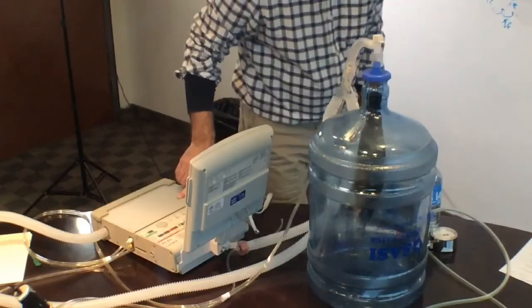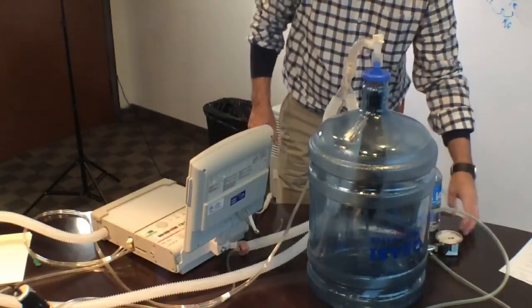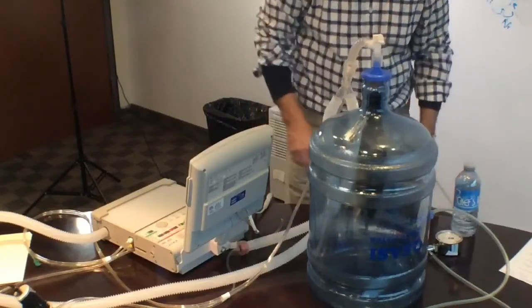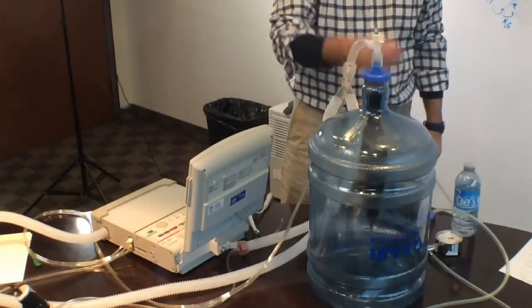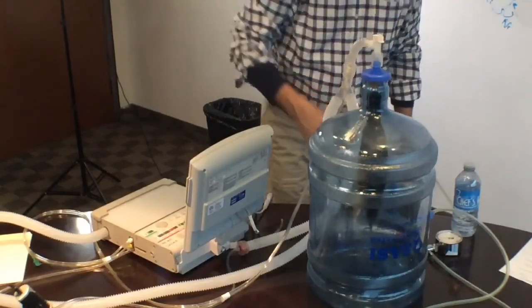Okay, so the honking sound that you hear, those of you from the CV4 days, sounds like the CV4, and it's exactly the same kind of principle. It's that gas that's trying to escape through a positive bleed valve.